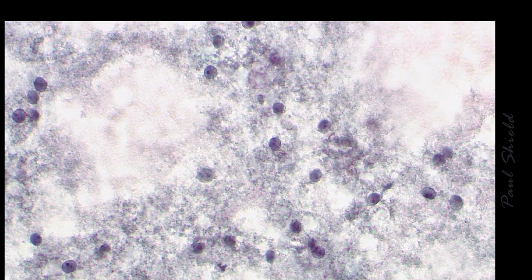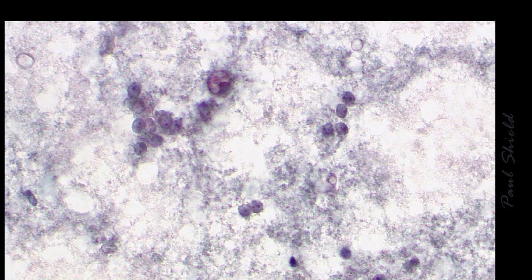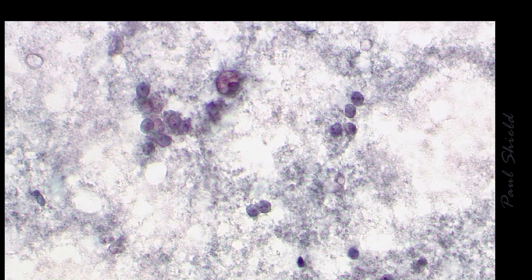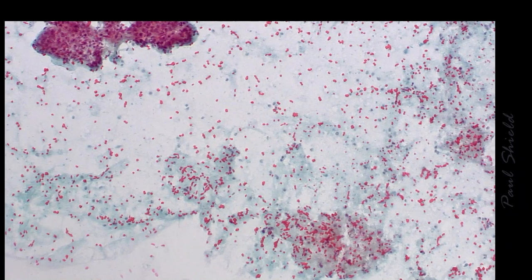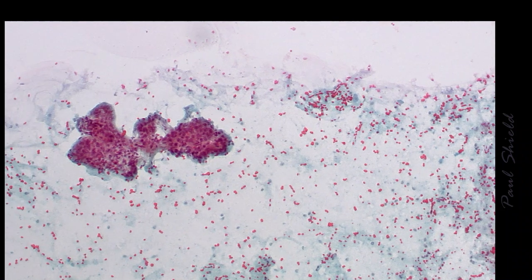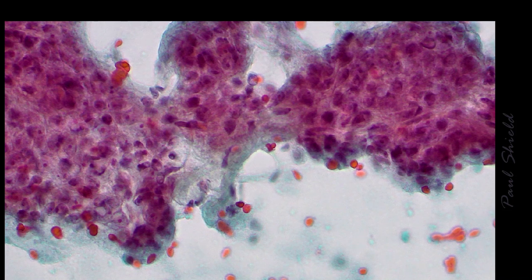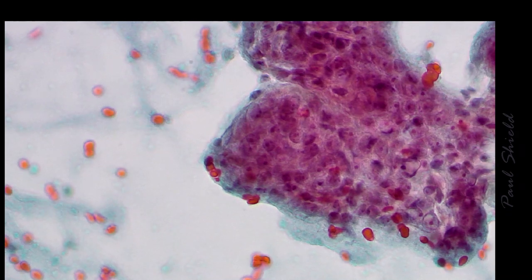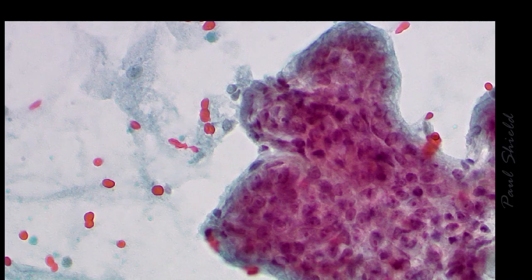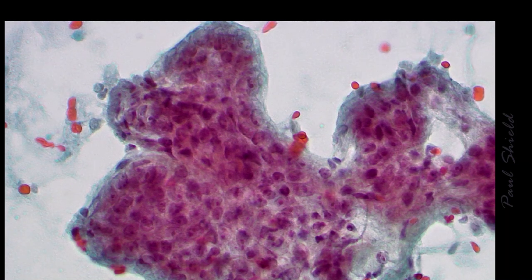And then throughout the background, you can see they're really quite dispersed, just as stripped nuclei, some cells with cytoplasm, but generally speaking, just single cells. Here's like a little lobular unit that's been sucked out, and you can see same features in it. So they are epithelial, they're cohesive, they have prominent nucleoli, and so this is like that hyperplastic terminal lobular unit that's been removed.